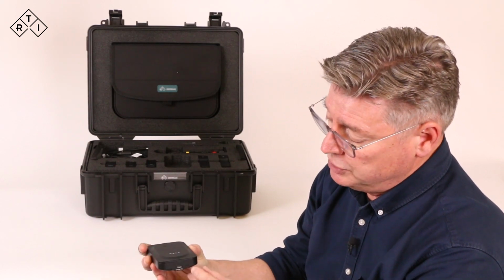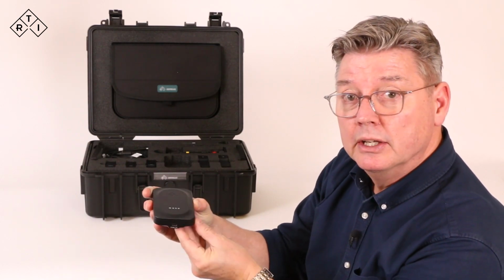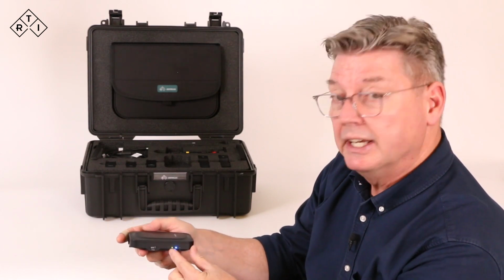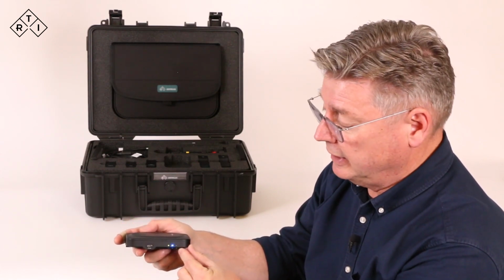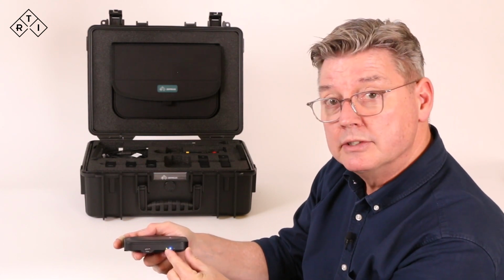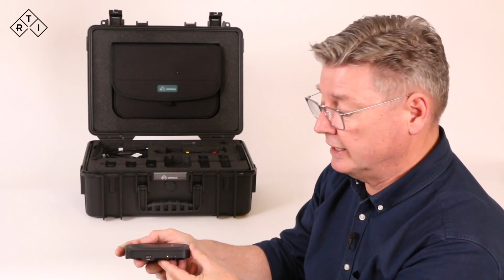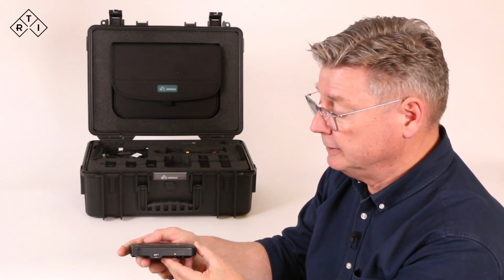base unit, switch it on by pressing the on-off switch. See that the LEDs will be activated. The green one indicates it's ready, and the flashing blue means that Bluetooth is activated and waiting to connect.